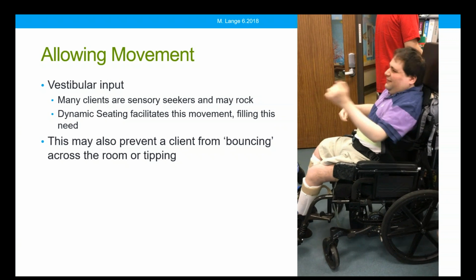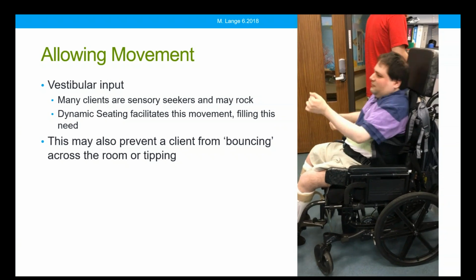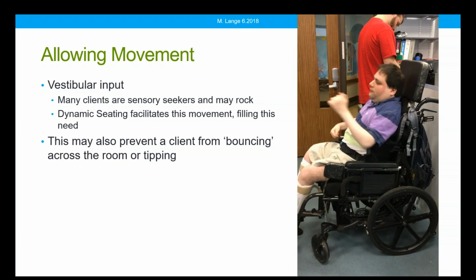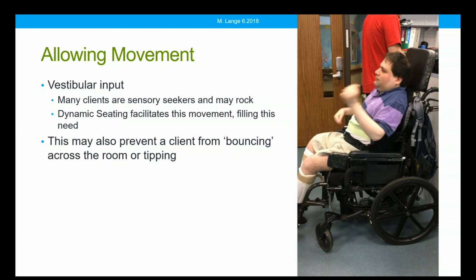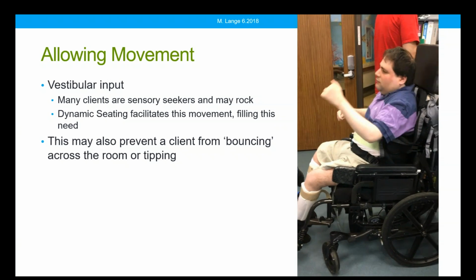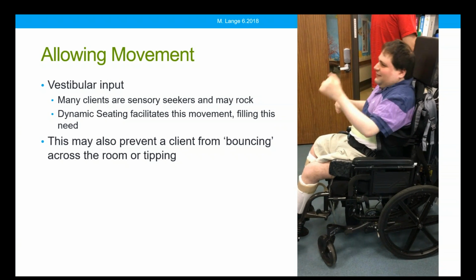I find that a lot of clients, once we provide that movement, definitely rock and roll for quite a while, but often then settle down and do begin to participate and be more functional because they know they can move when they need to. By providing movement, we can also keep the client from bouncing across the room or tipping over.